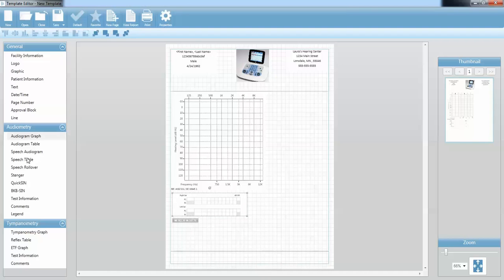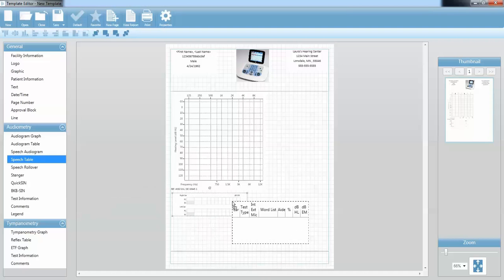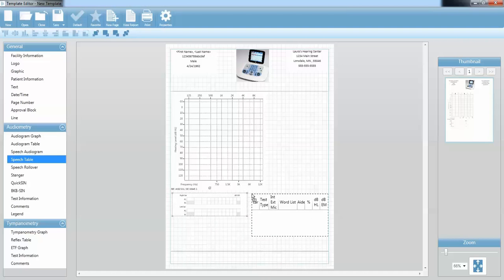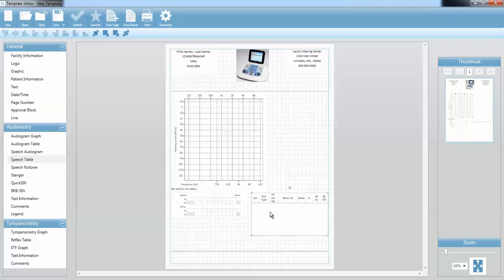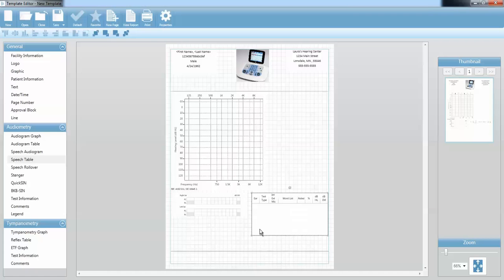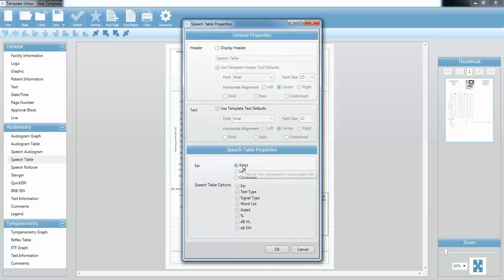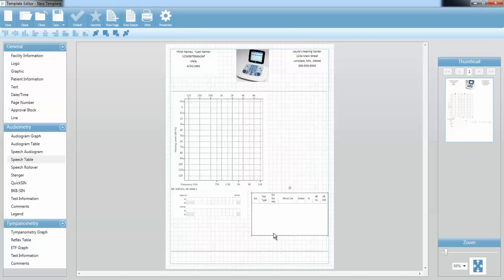Now I want to have a speech table. I do minimum speech testing in my facility, so I'm going to bring over my speech table here. I would like a border around that, so I'm going to go to the toggle border and it's going to make a nice border for me. I'm going to go to the properties where I can see this is right, left, or combined — I'm going to combine those results. I do want the ear, the test type, signal, word list, aided, and hearing level, so I'm going to keep all those things. I typically do just a couple word lists with each ear, so I'll resize that accordingly.